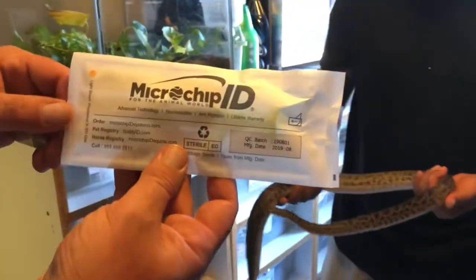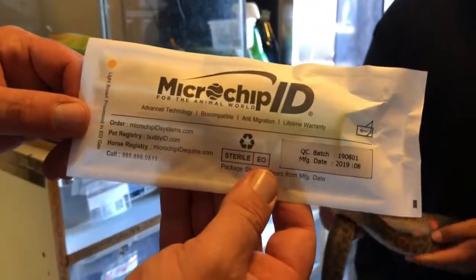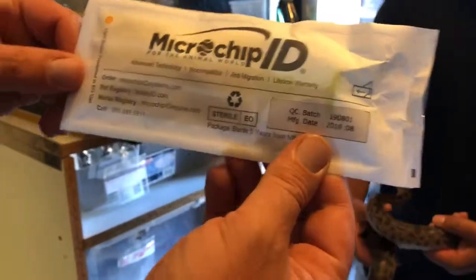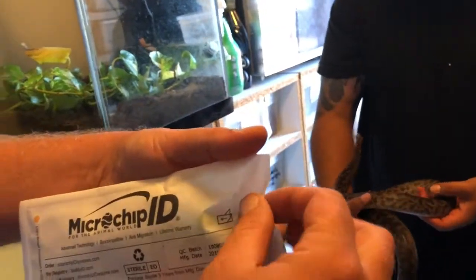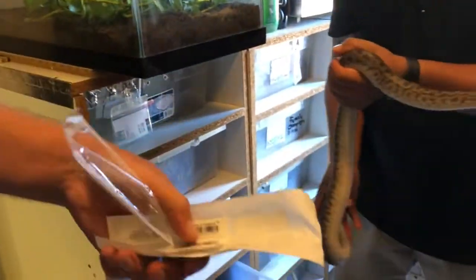Alright, is it recording? Okay, we got some microchips — we're gonna microchip some spider python females because they all look alike. Pop one of these bad boys open, it's got the numbers and it's got the microchips.